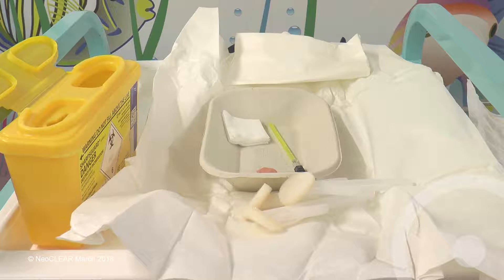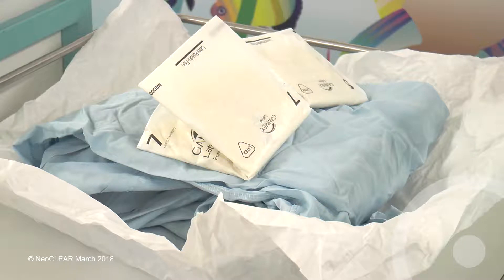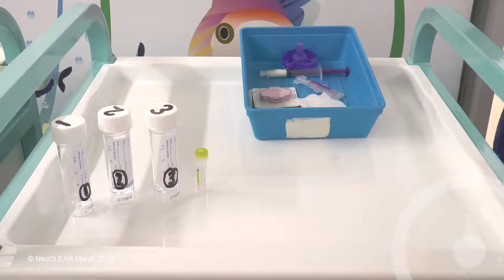Prepare the equipment including a 22 gauge quink LP needle, sterile pack, chlorhexidine and alcohol based cleaning materials, two pairs of sterile gloves and a gown. Label three sterile pots alongside a glucose tube and loosen the lids. Prepare equipment for checking blood glucose, a pacifier with parental consent or gloved finger, and appropriate milk or sucrose solution.